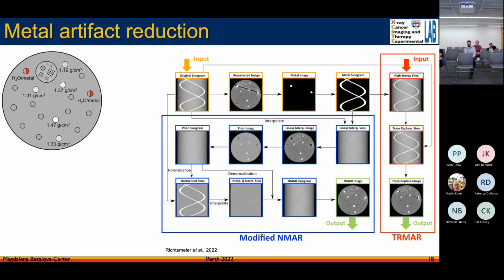And this is really how the technique works. There are a number of other techniques that people have used, but I'll just talk about ours first. So we get our sinogram. Not sure if you're familiar with a sinogram, but it's basically just the raw data that we get from the detector. We reconstruct an image, and again, it suffers from metal artifacts, as you can see in the middle over here. And again, we put the resolution piece in between purposely, because we want to see how we can reconstruct the resolution piece, the holes and higher density pairs, with the different image reconstruction techniques.